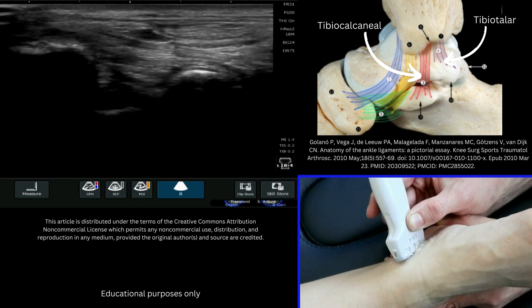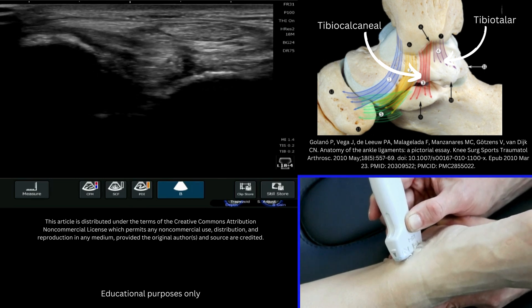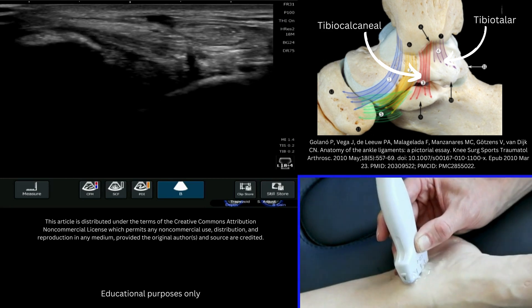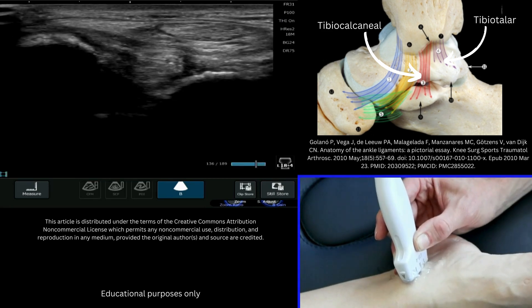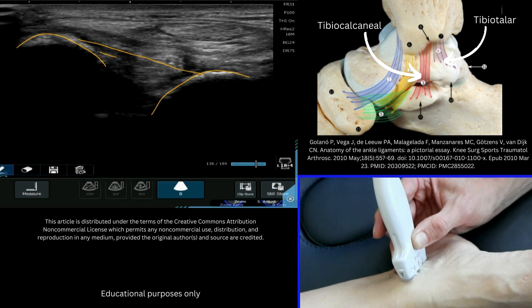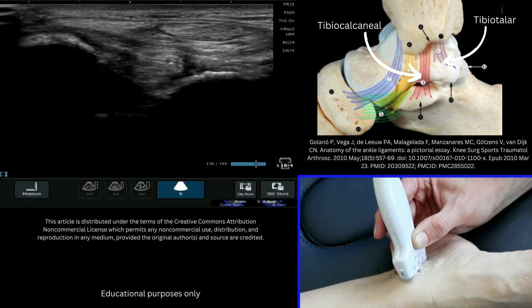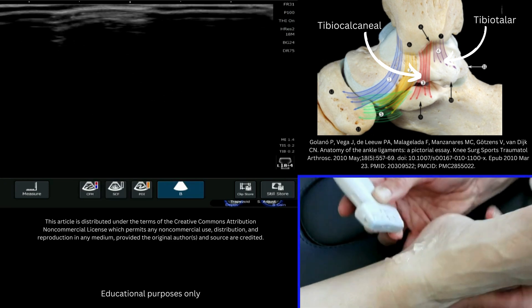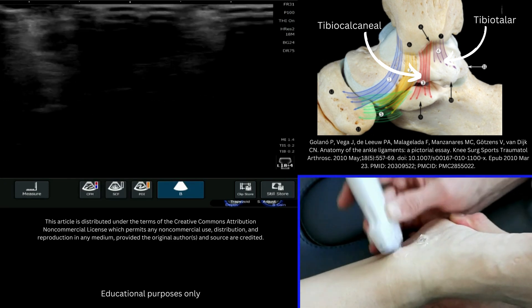You can see those sitting there in that recess, and if I freeze that image we can annotate those fibers. This is the medial malleolus, this is the talus, and in here are the deep fibers of the tibiotalar ligament. The greater range of motion the patient has, the more you'll be able to expose those fibers and see them clearly.